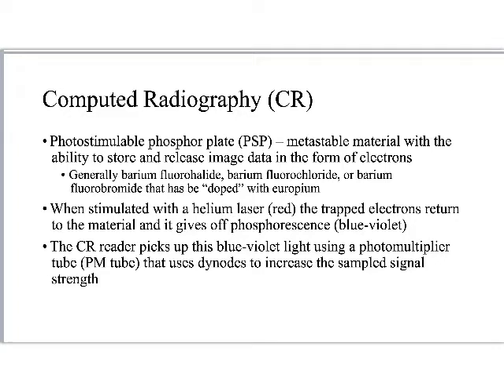The europium traps that electron, right? And so we now have a latent image on the PSP. The information is there, but it's not yet been sampled, right? So we've not yet done anything in that first step towards digitization, right?